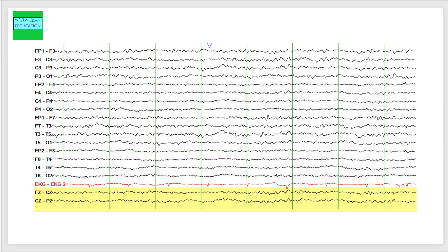We see a marked asymmetry in amplitude and frequencies between the left and the right hemisphere. The amplitudes on the right hemisphere are significantly lower as compared to the left. Number two, the mixture of frequency is more rich and more pronounced in the left hemisphere and we have a poor mixture of frequencies on the right hemisphere.